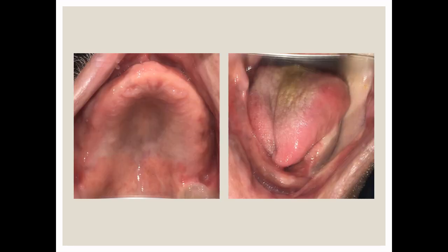This is the intraoral view of the maxillary and mandibular arches, and one thing you can clearly appreciate is the close approximation of the tongue to the alveolus on the non-defect side. So the placement of impression material into the lingual sulcus on the non-defect side is difficult. In this case you can use a disposable syringe to inject the impression material into the areas of difficult access prior to seating the tray with impression material.